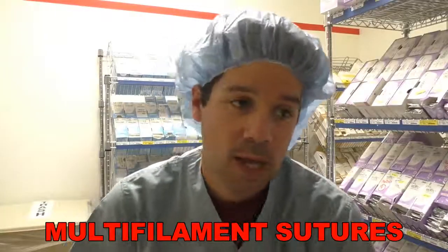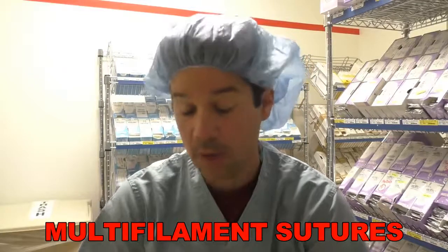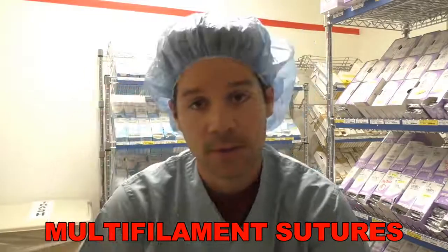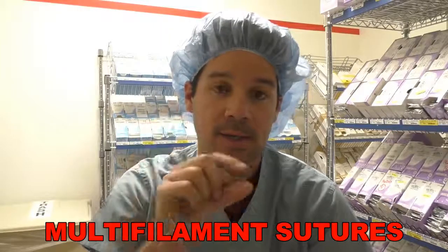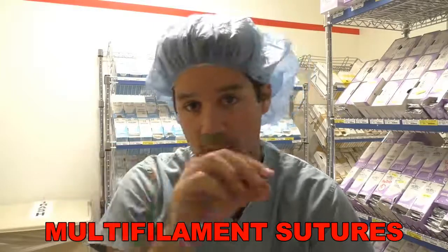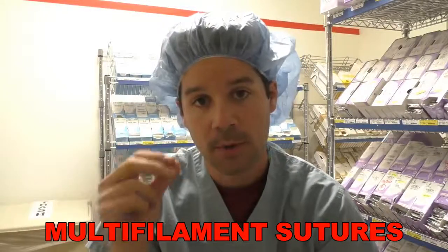Multifilament sutures. I want to talk about those first because there's not a lot of them, actually. I looked through this whole suture room, and there's only 4 different multifilament sutures. And remember, the multifilament is single filaments strewn together and twisted. It's a braided suture.